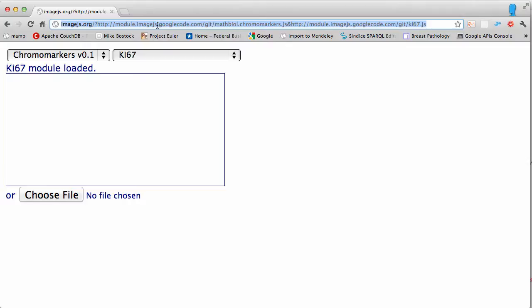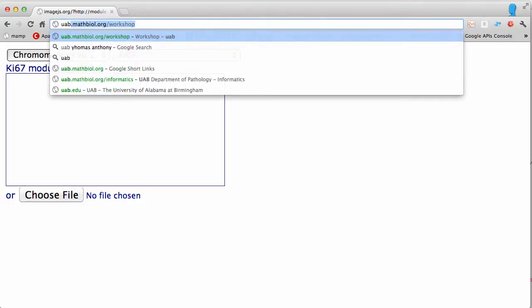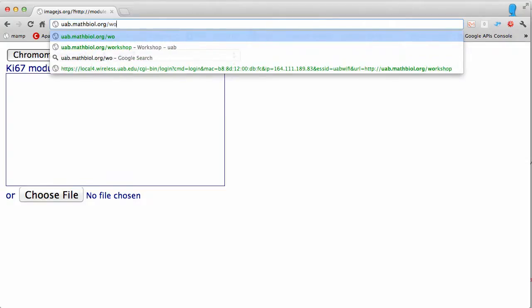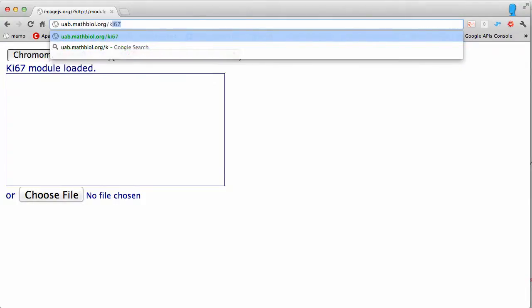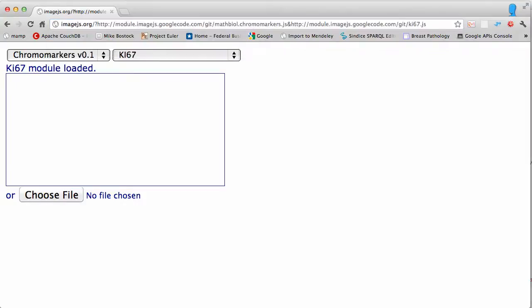The ki67 module specifically expects the chromo markers module to be there as well, following the layering approach described in the manuscript. Another shortcut that will take you to the same combination of modules is uab.mathbiol.org/ki67. Now a quick explanation of the nature of the problem with transmission microscopy images.